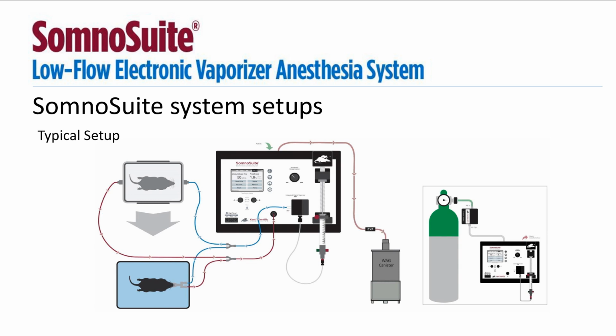Perfect. And if you decide to use compressed gas, notice in this insert here, we have our preset pressure reducer connected between the two systems, between the compressed gas as well as the SomnoSuite. The important thing to note is that if you do decide to use the compressed gas, the incoming pressure must not exceed 15 psi. So we have the preset pressure reducer to reduce the pressure down to 15 psi, so you can operate your SomnoSuite optimally.